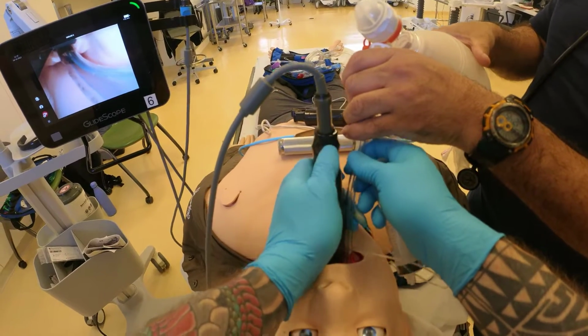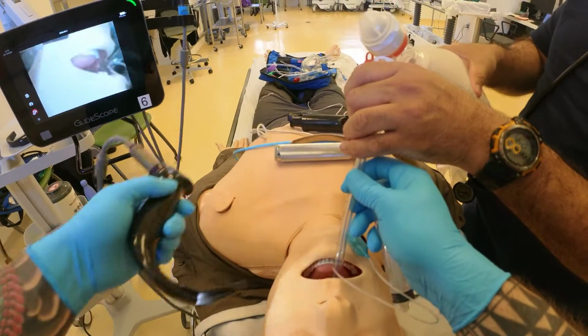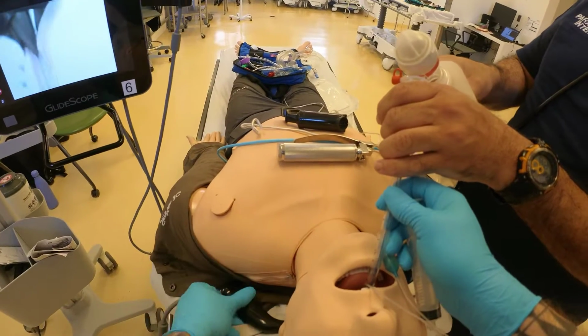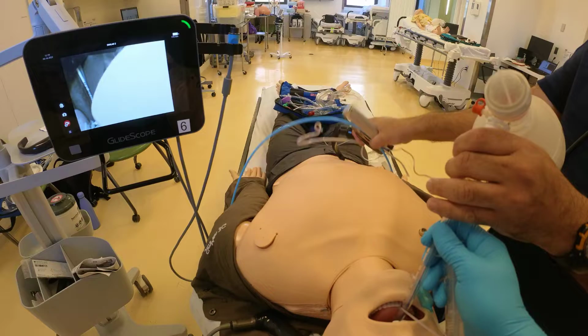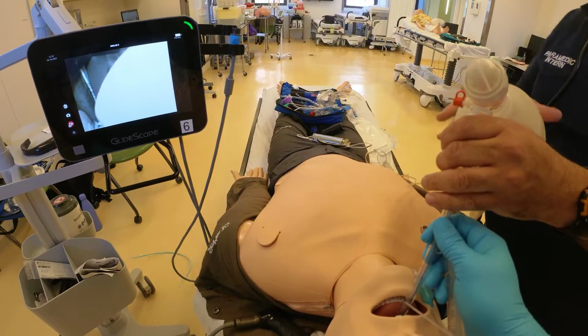Then what we see is a good chest rise. So you're going to squeeze the bag again.